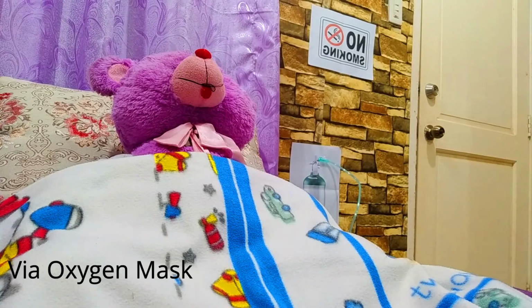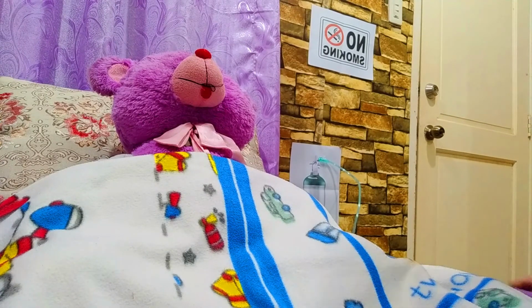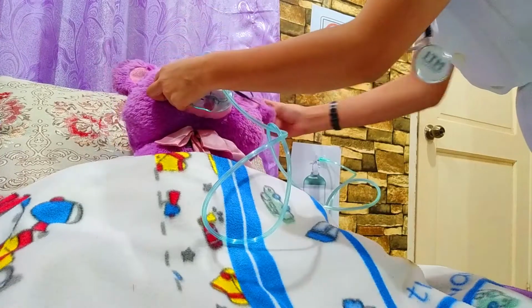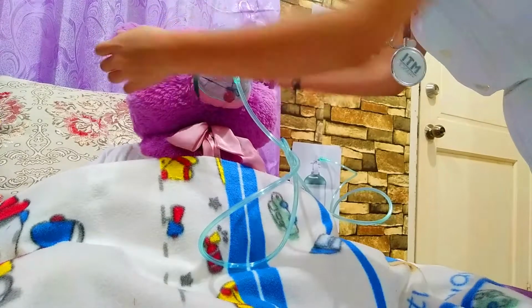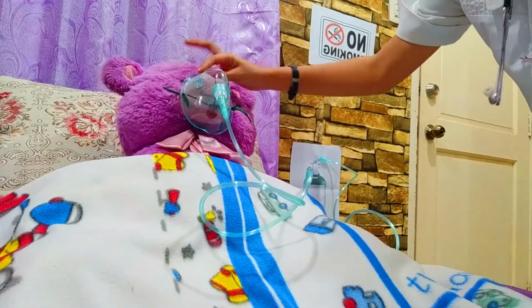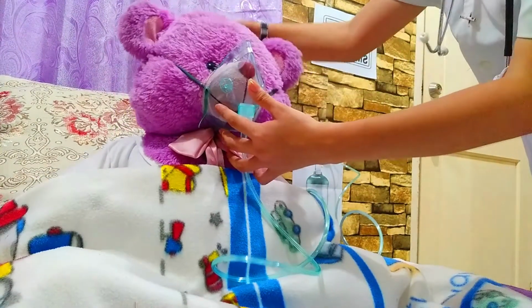And for administering oxygen via simple oxygen mask, we need to place the mask over the nose, mouth, and chin, and then adjust the strap at the nose bridge. We need to adjust the strap at the nose bridge and pull the elastic band around the back of the head.